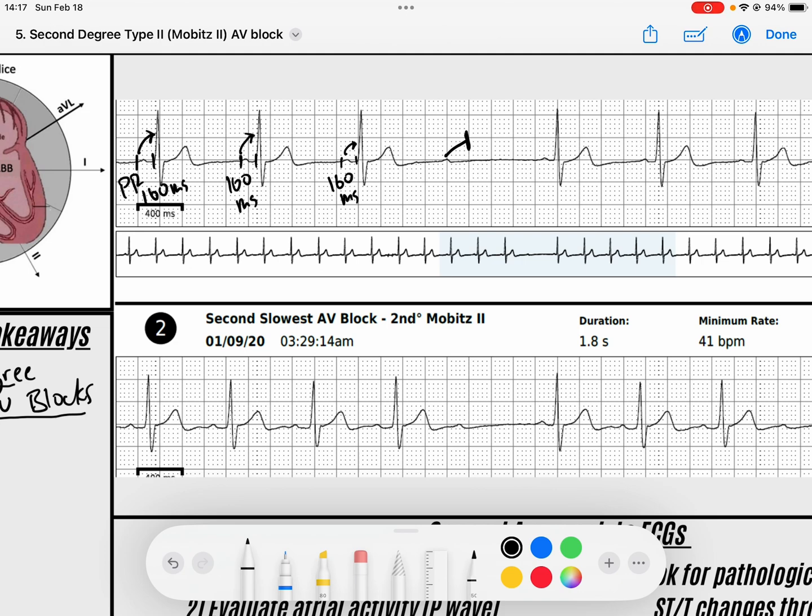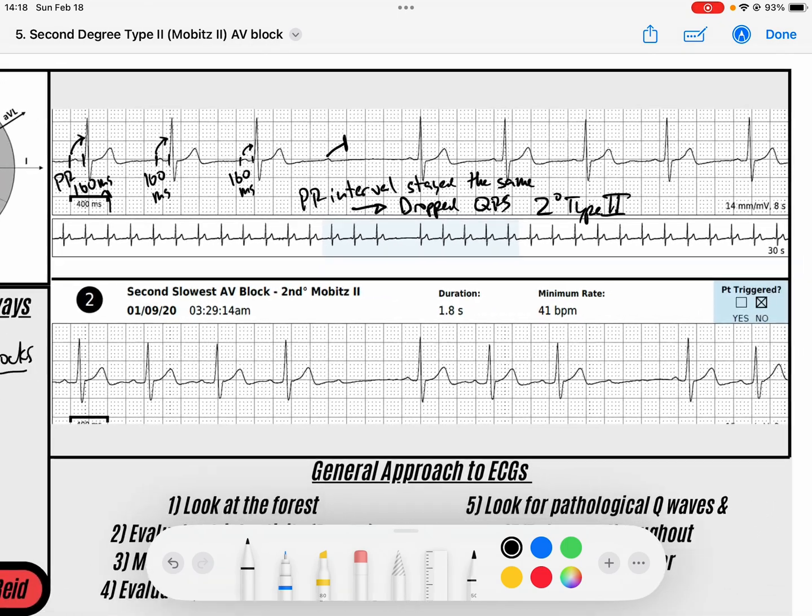That tells me, where did that P wave likely get blocked? Probably not by the AV node itself, because the AV node, which is what is slowing the signal down, is doing it appropriately every single time - 160, 160, 160. But because this one gets blocked, this tells me that the PR interval stayed the same until it dropped a QRS. We know that the only way that would happen is if there was a block at the His bundle, which is a second degree type 2 AV block.